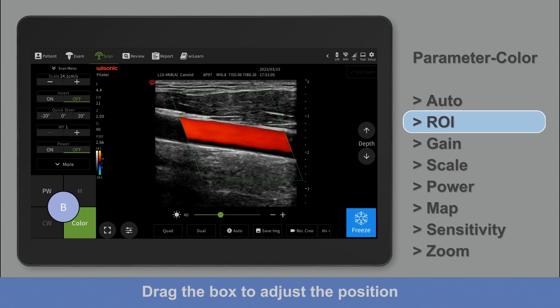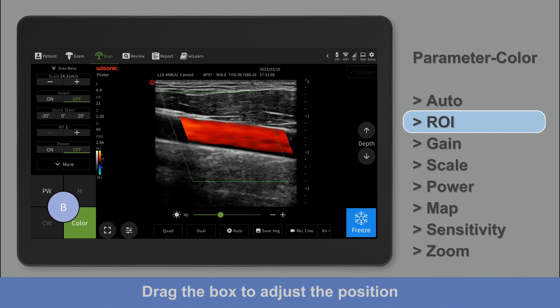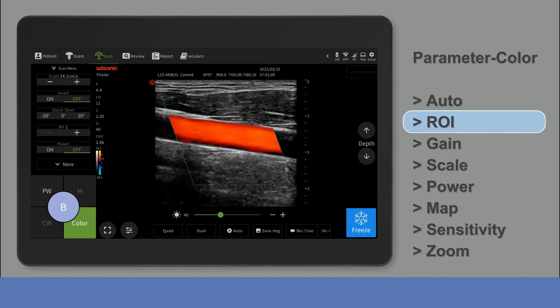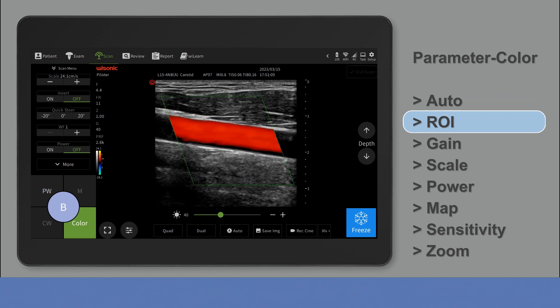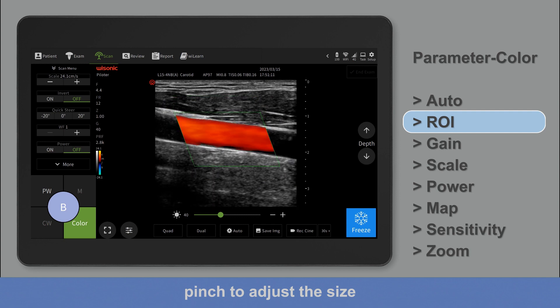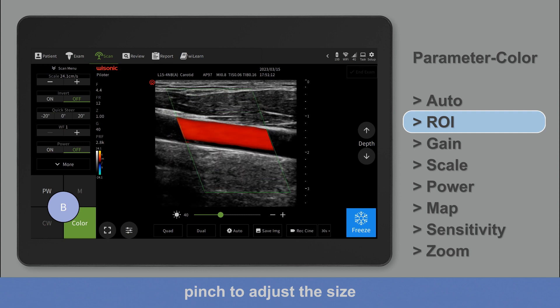Drag the box to adjust the position. Pinch to adjust the size.